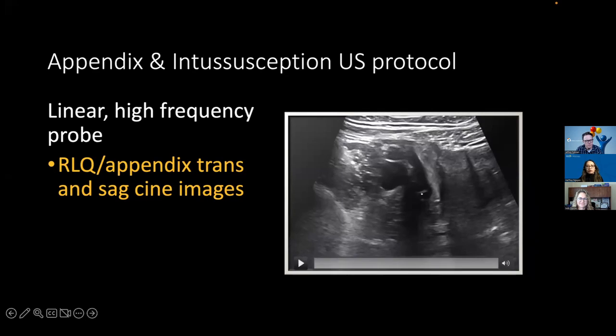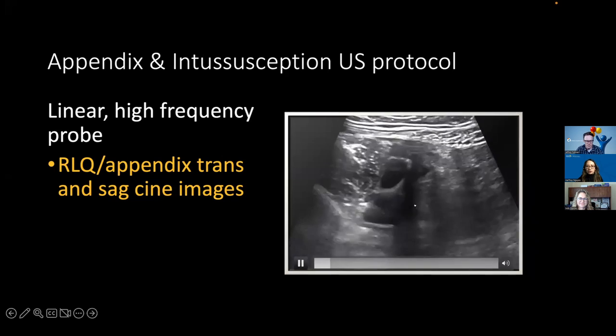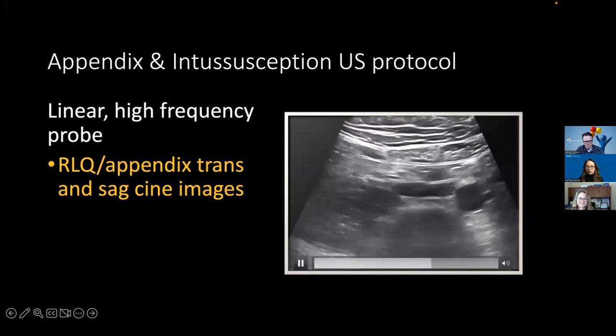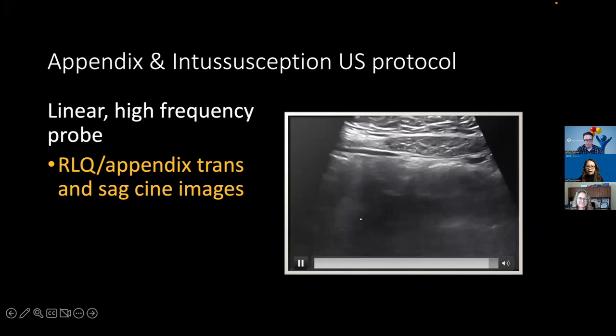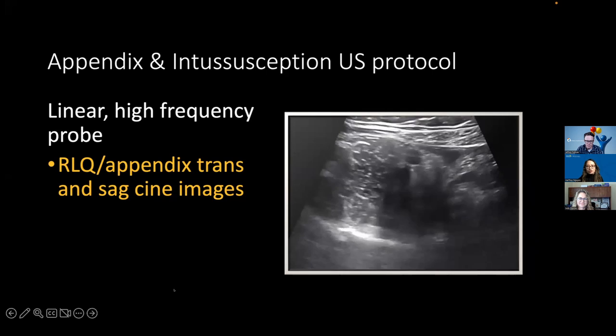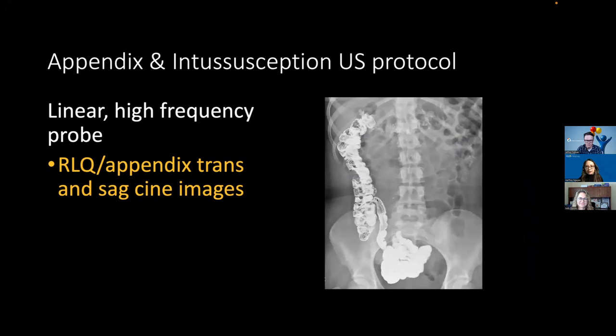All right, so now we want to focus on the bowel itself. In the setting of looking for the appendix, you want to do your due diligence in the right lower quadrant, look where the iliac vessels are, because usually that's where the appendix may lie. However, my argument is you can't just look in the right lower quadrant, because depending on how the body is built, you don't know where the appendix is. So when I search for the appendix, I actually scan up and down the whole hemiabdomen, because the appendix might be retrocecal and extend a little more peripherally.